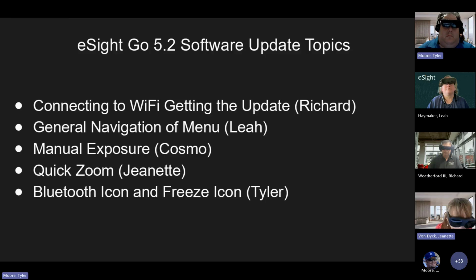Now, the other feature about this that I want to tell you is that if you have a few things that you want to look at while you have pressed that button and you are in the zoom mode, it will stay there for about 28 seconds. As long as you've got your finger pressed down on that quick zoom, I counted it, it's going to stay there for about 28 seconds.